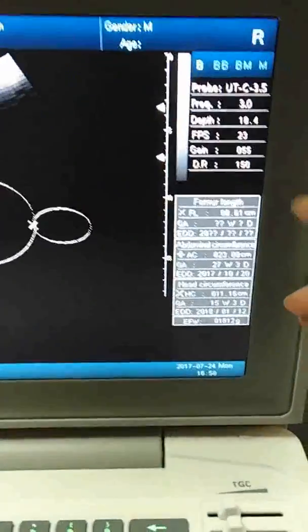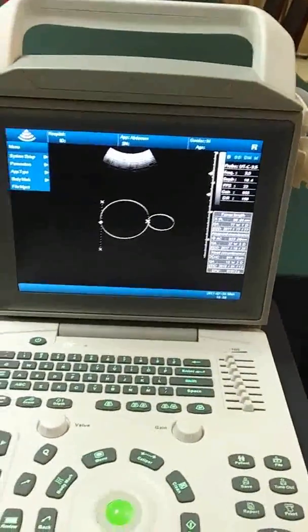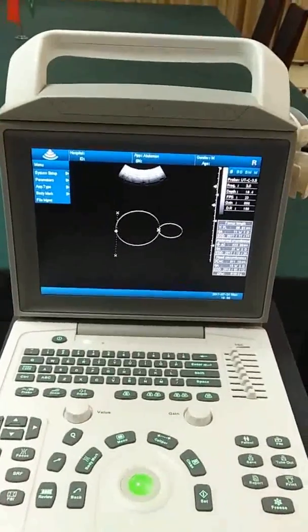Here we can see the result. It is really very easy to operate and it is really a good machine. Thank you.